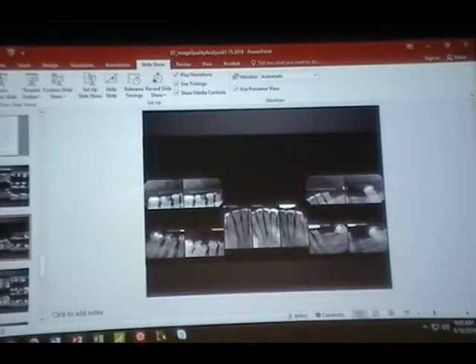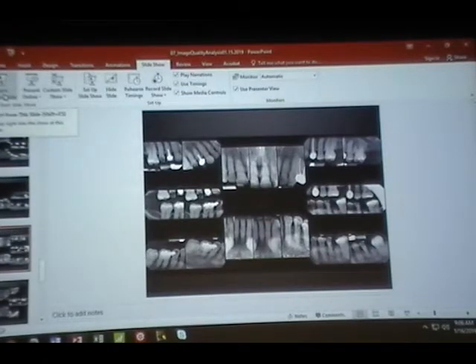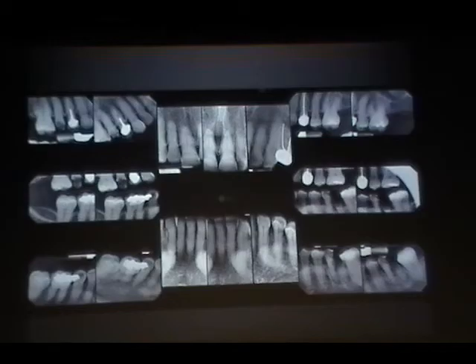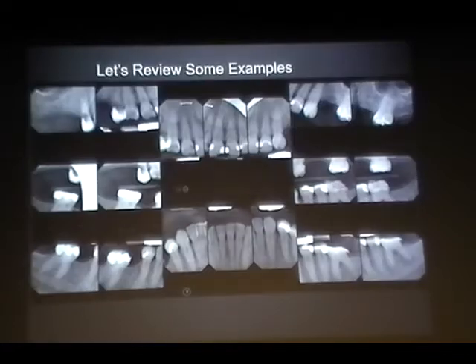Is there any particular reason you're not wearing the rubber denture for the X-rays? To push the sensor down? Is there a reason that the patient is not wearing a denture? Unless they don't have it. If there's no metal, it shouldn't matter.